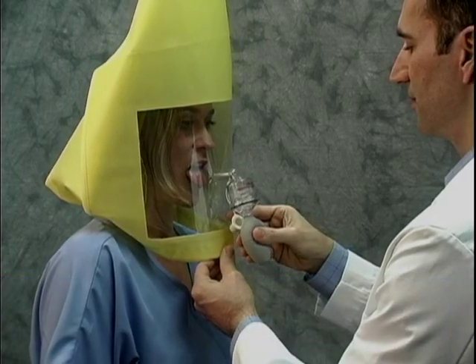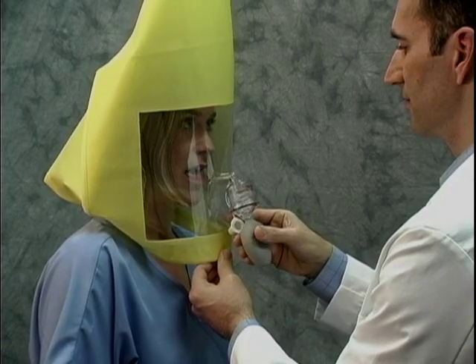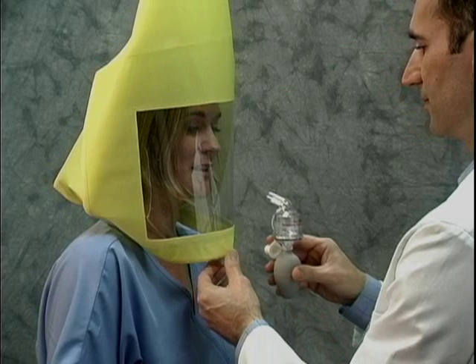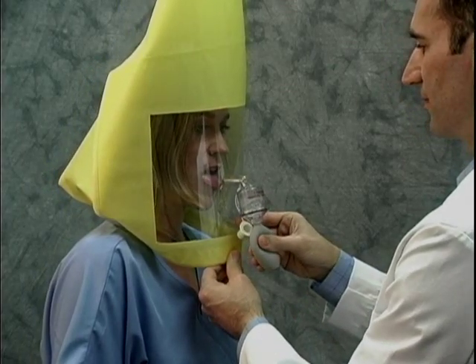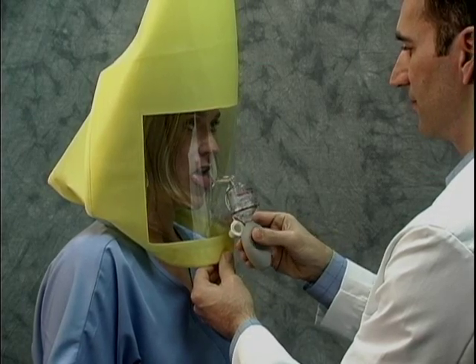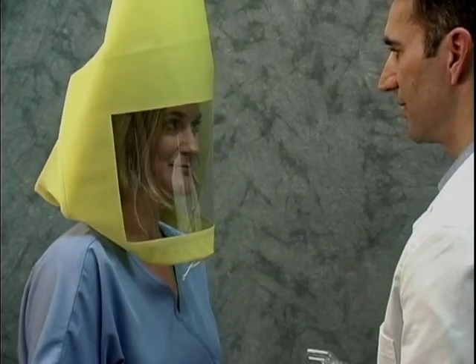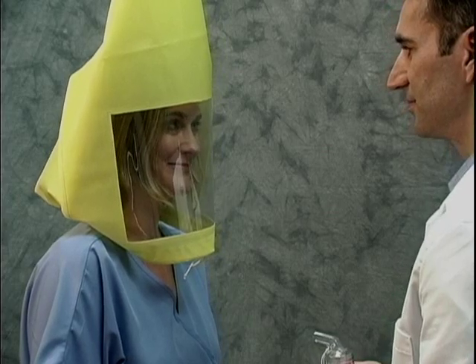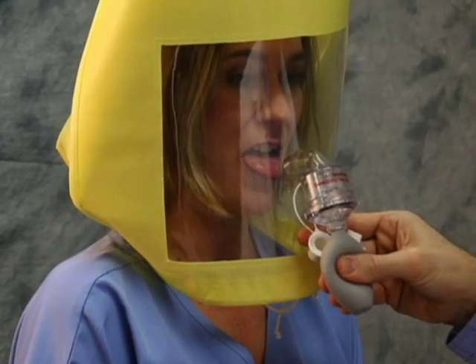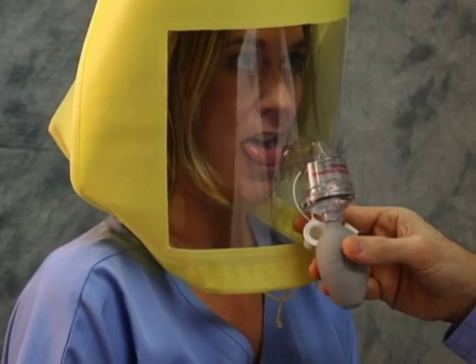You must breathe with your mouth open and your tongue slightly extended. If you taste the test agent, tell the instructor. The taste threshold will be noted as ten regardless of the number of squeezes actually completed. If you can't taste the test agent after ten squeezes, the instructor will put an additional ten squeezes into the hood. If the taste is detected during the second ten squeezes, the test is completed and recorded as 20.